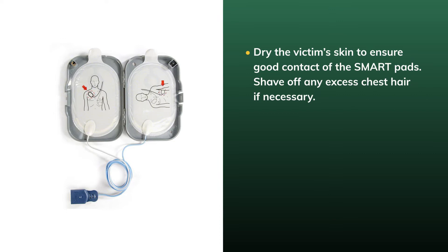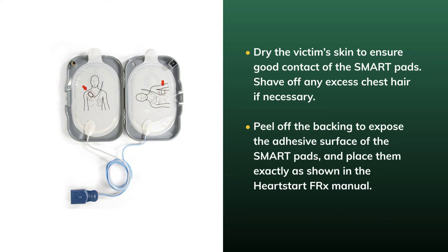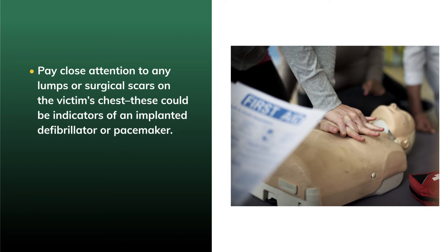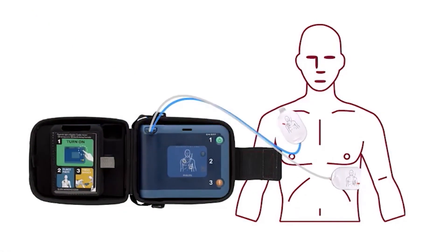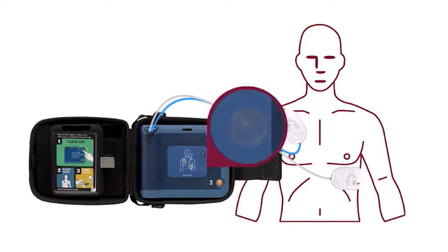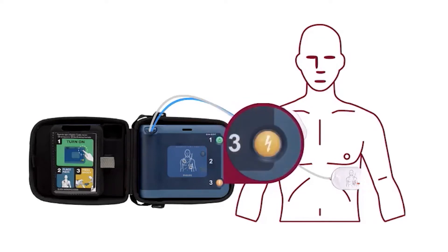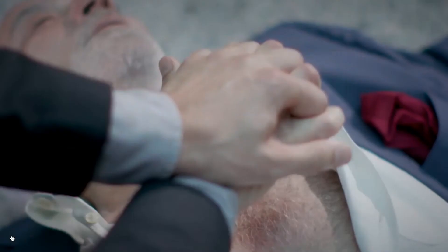Dry the victim's skin to ensure good contact of the SmartPads, and shave off any excess chest hair if necessary. Peel off the backing to expose the adhesive surface of the SmartPads and place them exactly as shown in the HeartStart FRX manual. Pay close attention to any lumps or surgical scars on the victim's chest, as these could indicate an implanted defibrillator or pacemaker — avoid placing the pads over these areas. The HeartStart FRX will start analyzing the victim's heart rhythm as soon as the pads are attached. The caution light will flash, indicating nobody should touch the victim. If a shock is required, the caution light changes to solid, the orange shock button begins blinking, and users are prompted to press it. Before pressing, make sure nobody is touching the victim. The HeartStart FRX will apply the shock and announce it is safe to begin CPR.